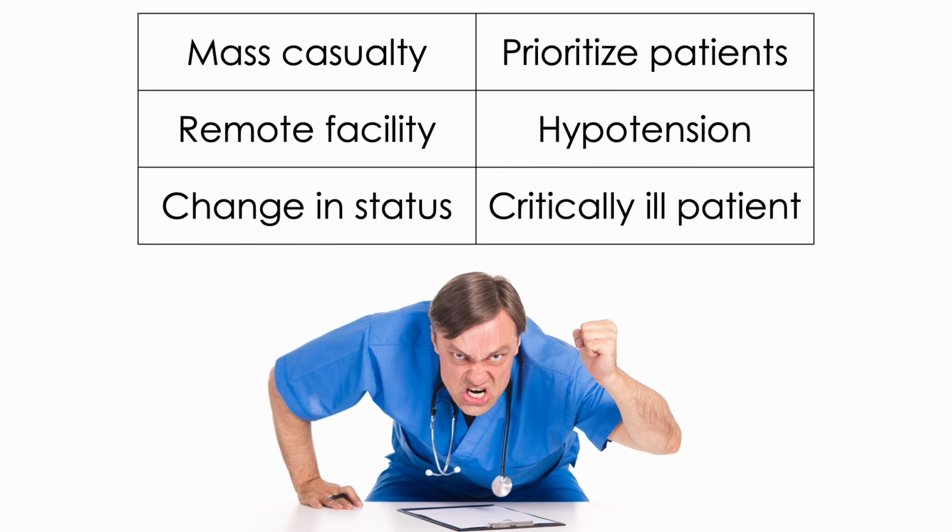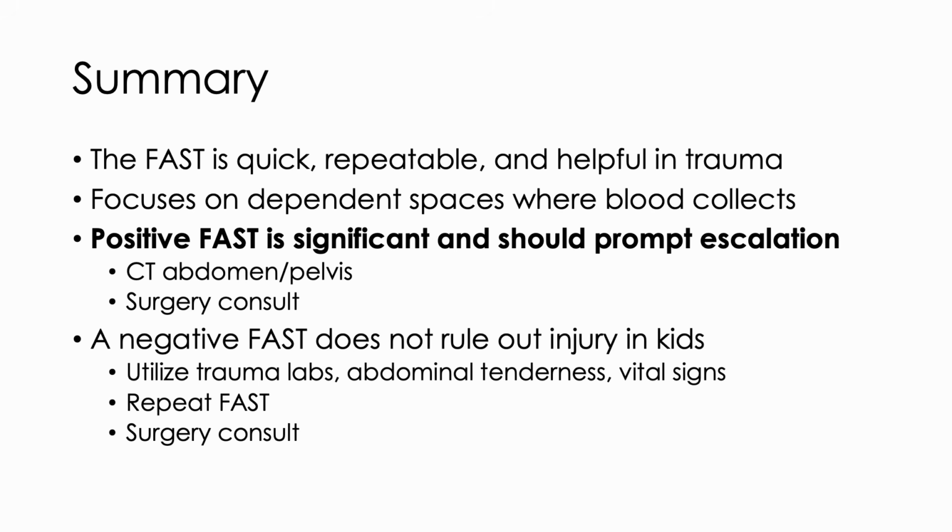Also, if your patient has a sudden clinical deterioration, it would be nice to know if hemorrhagic shock is the cause. One of the unique aspects of the FAST is the repeatability of the exam. If the initial FAST is negative and the patient's status changes, you can repeat it. More time may allow for more blood to accumulate. In summary, the FAST exam is quick, repeatable, and helpful in trauma.